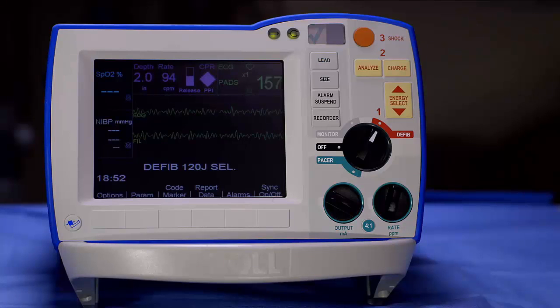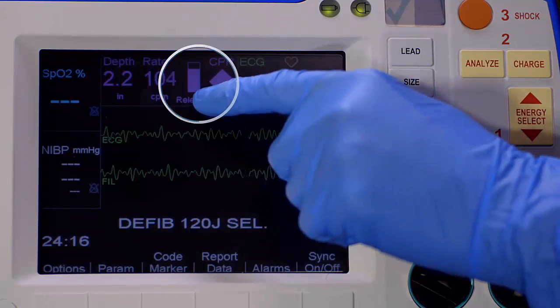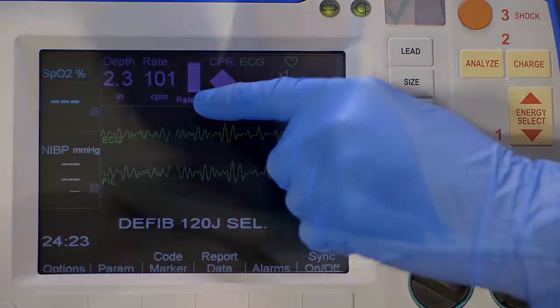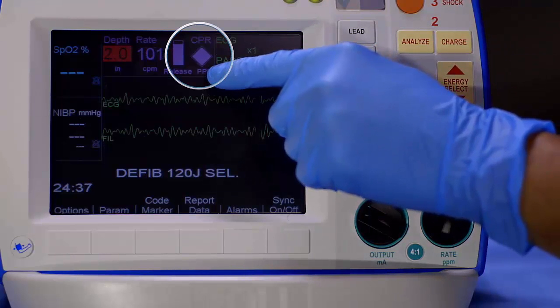This real-time feedback can help ensure you are doing high-quality chest compressions. The release bar measures release velocity to determine that rescuers are allowing sufficient time for cardiac filling. The bar should be completely full of color. If the color begins to decrease, make certain the rescuer is coming completely off the chest for full recoil.